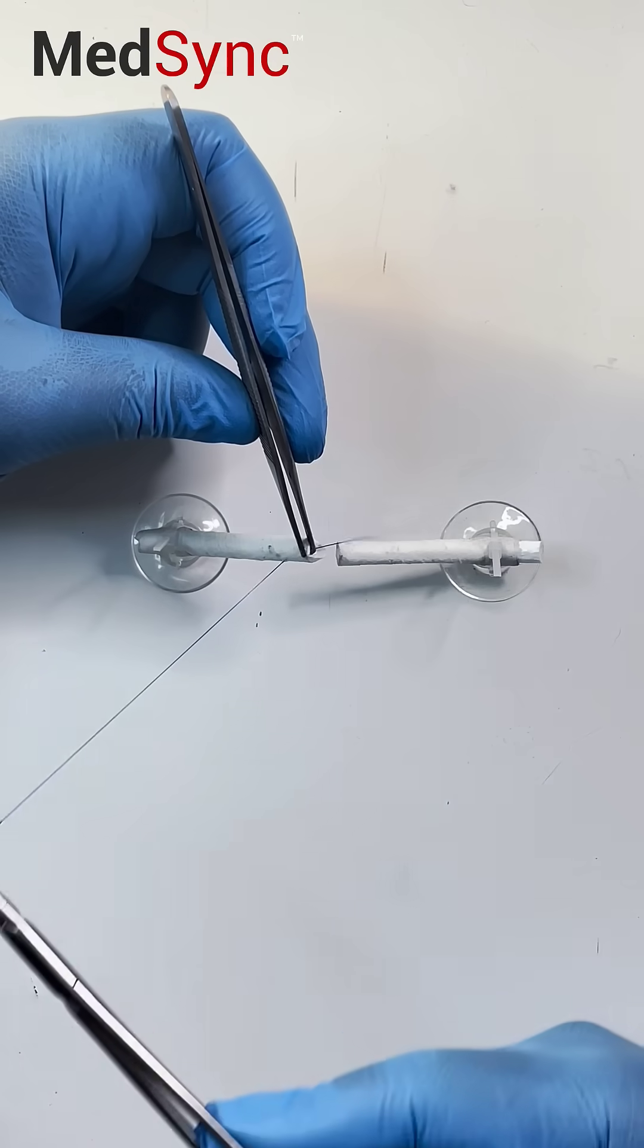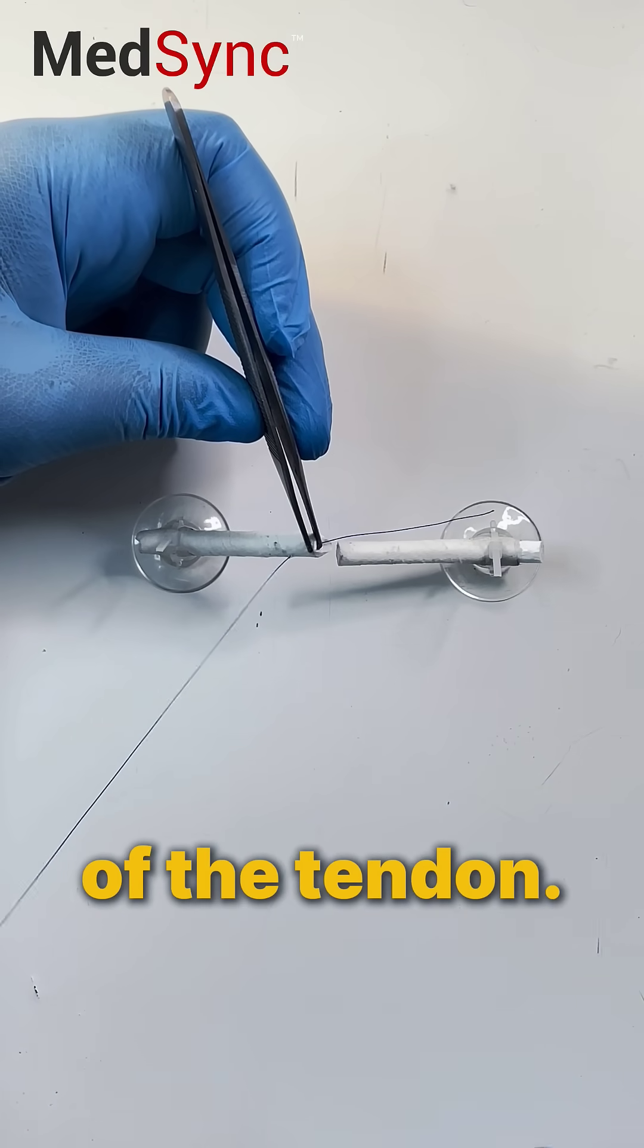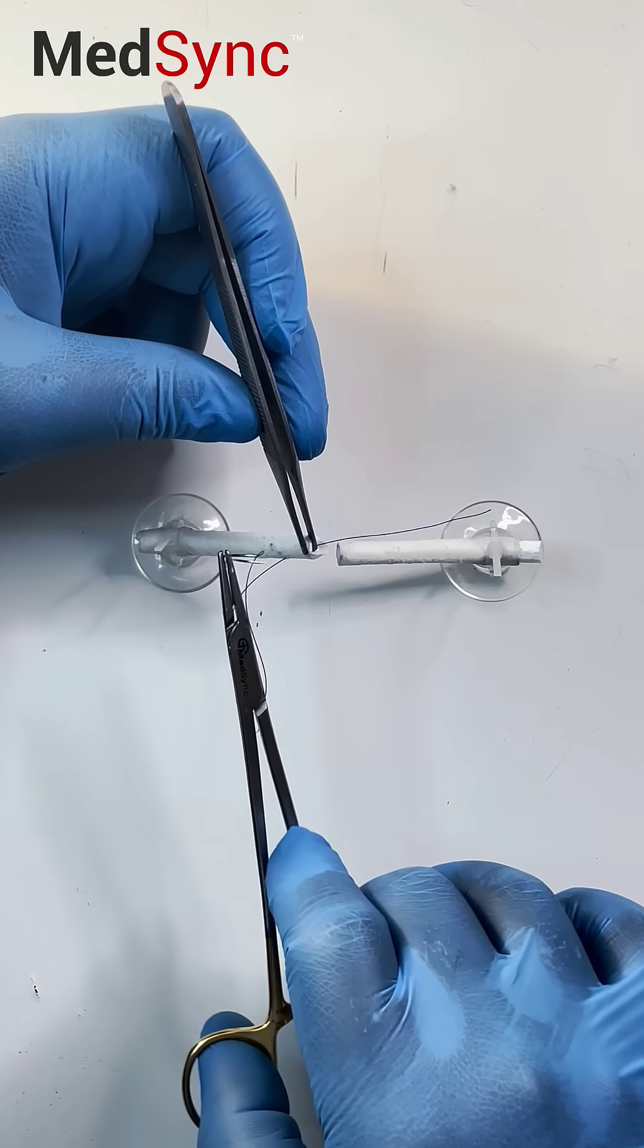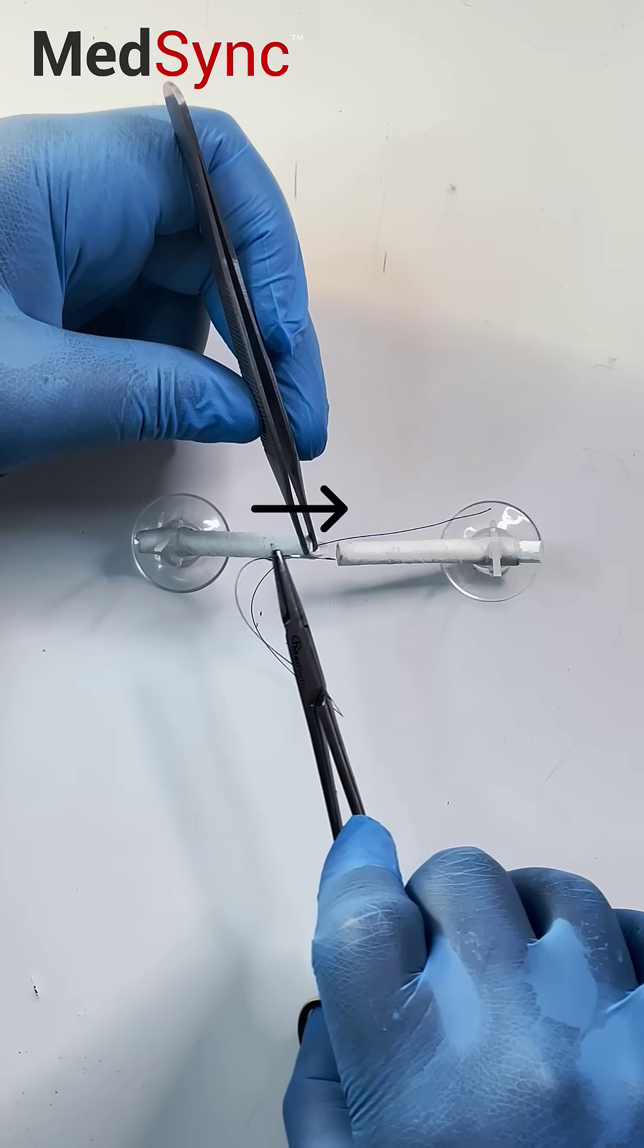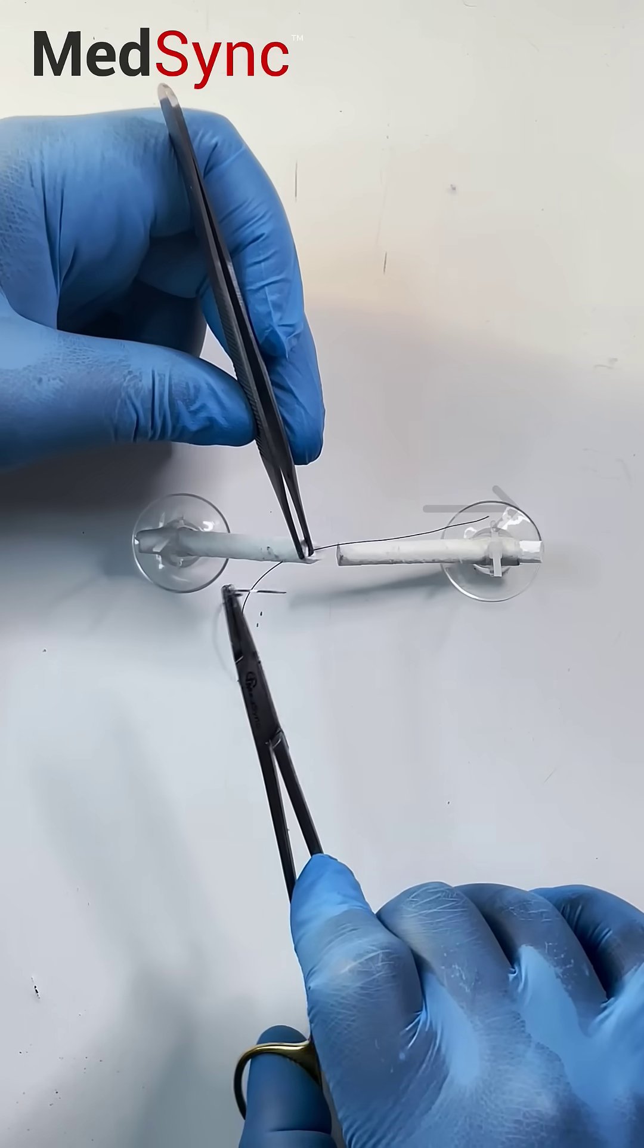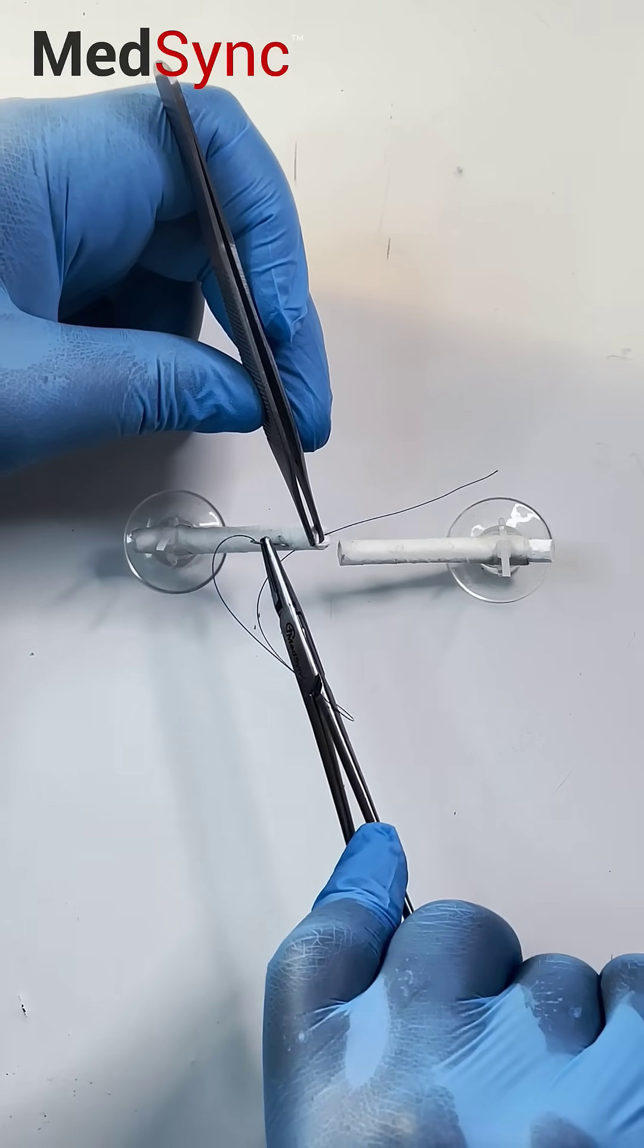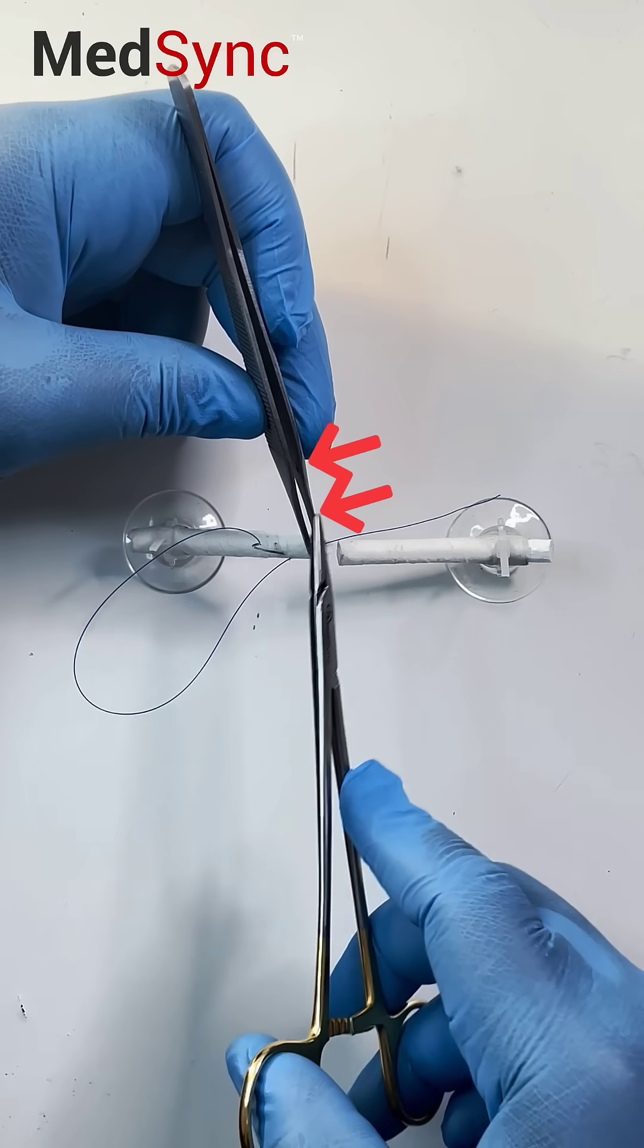You need to show off a little bit. Don't let go of the tendon. Turn the needle around and drive it straight back completely longitudinally in the direction of the tendon like this. You keep the counter traction and tension.